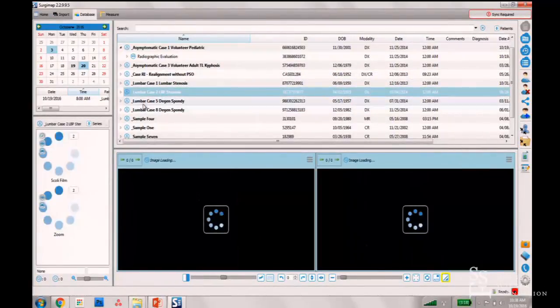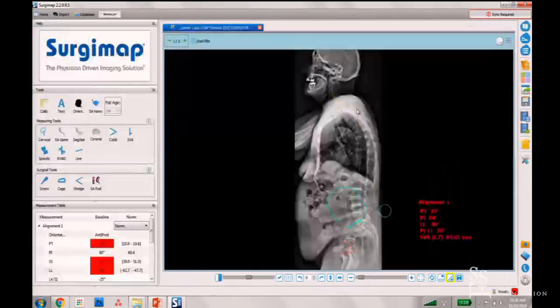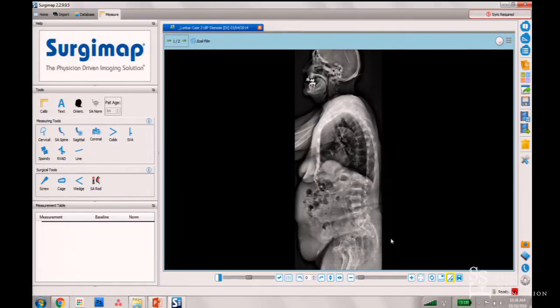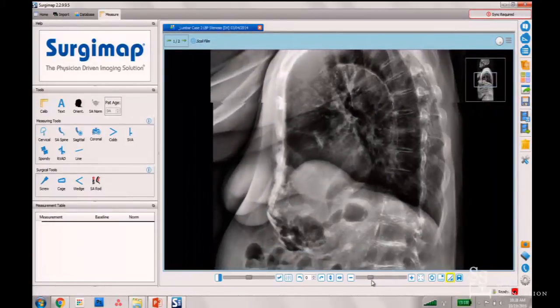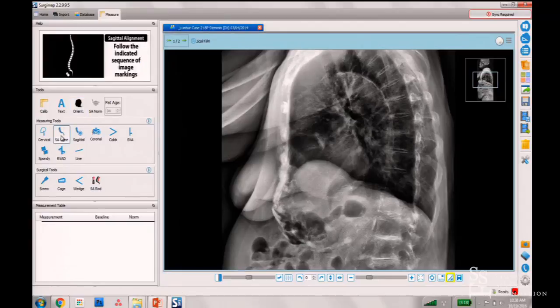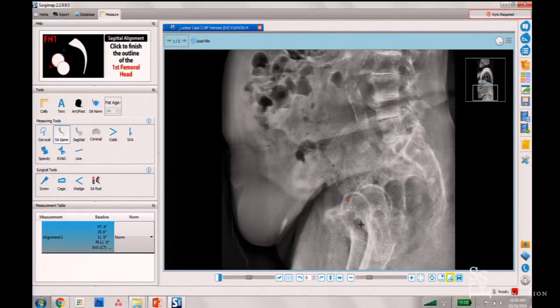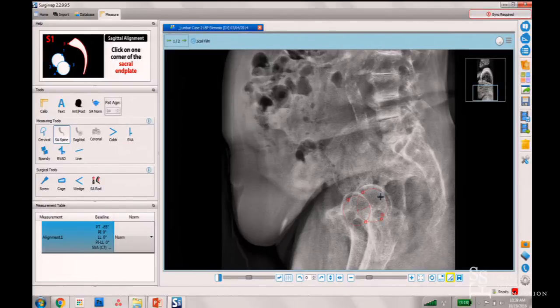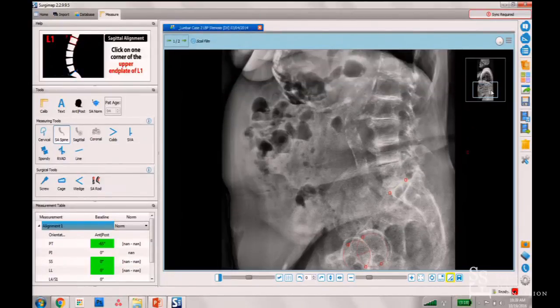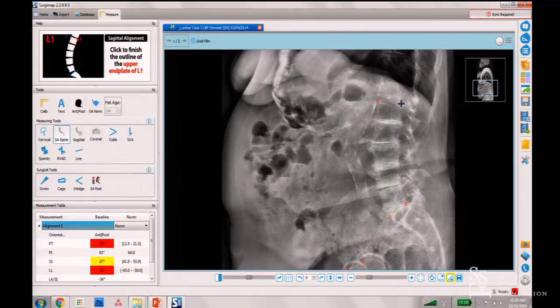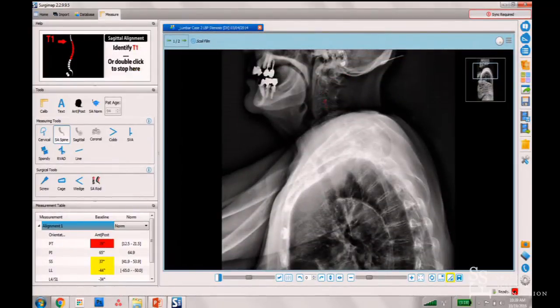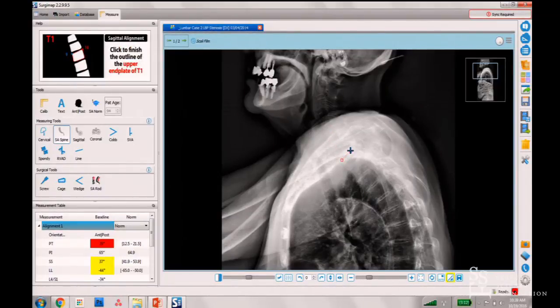Let's take this patient — a 94-year-old — and start from scratch. To do the measurement, use the Sagittal Alignment Tool in the upper left corner. When you click on it, follow the animation. Identify the first femoral head, then the second. The software then prompts you to identify S1, then L1, then skip to T1. If you don't have the cervical spine, you can stop there. If you do, click on C2.